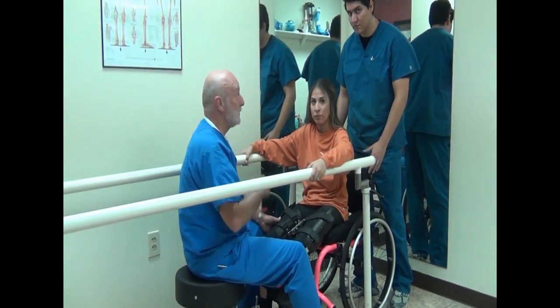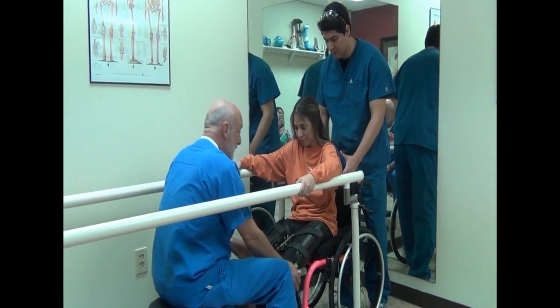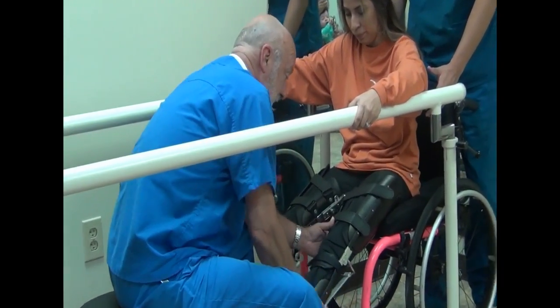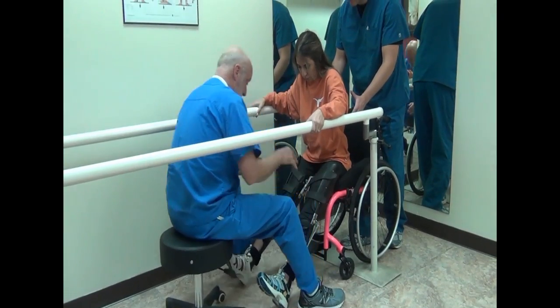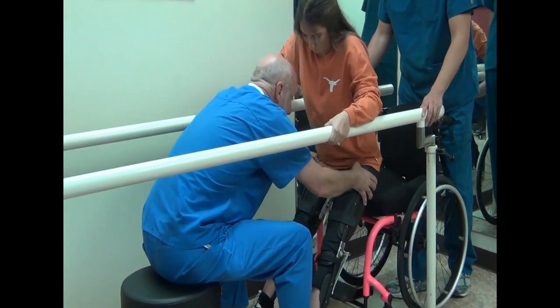This is Alberto Adame. He's a Baylor resident doing his residency here, doing his Masters in this. So what we want to do is lock out the knees, heel on the ground. I want you to slide forward in the chair to where both heels are on the ground, and then lock your hands up and stand.